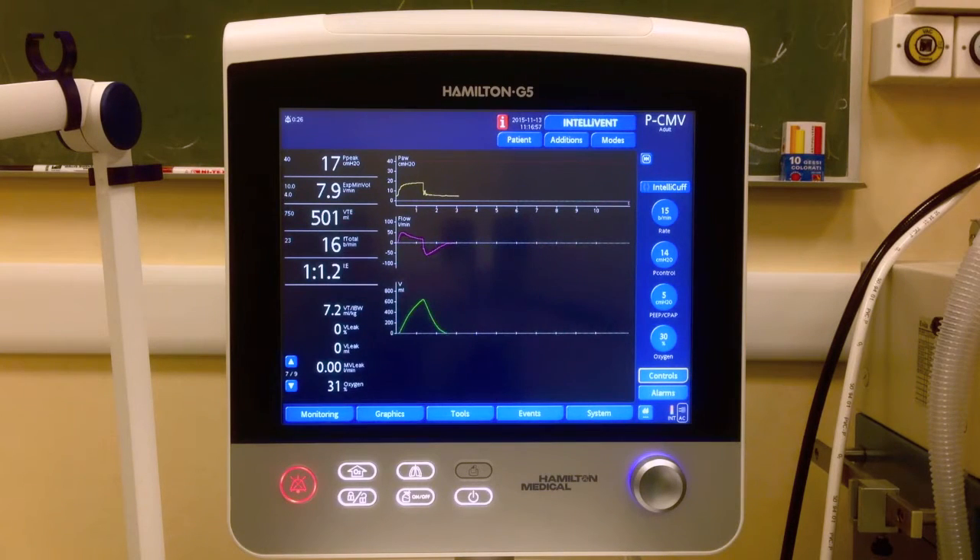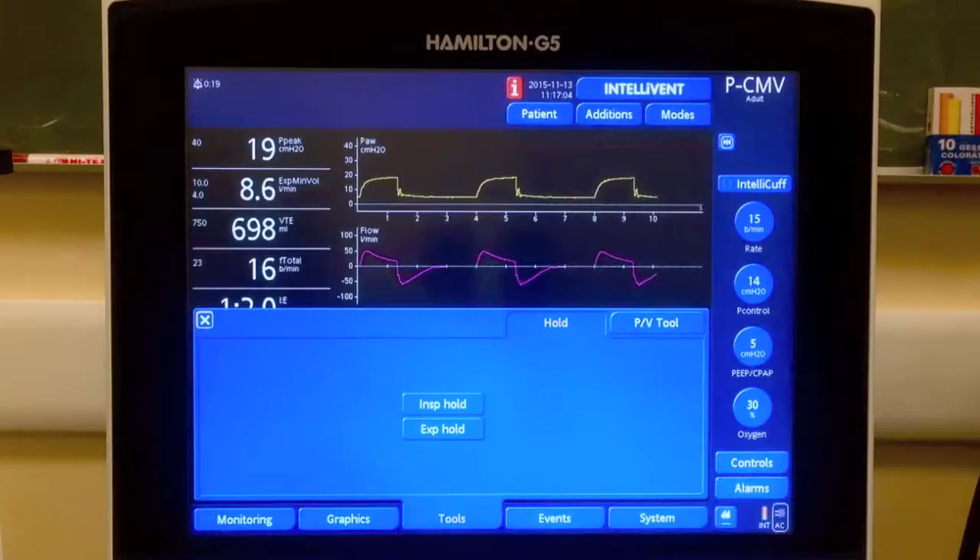This is how we can measure the plateau pressure and the compliance of the respiratory system during pressure control ventilation with our Hamilton G5 ventilator.